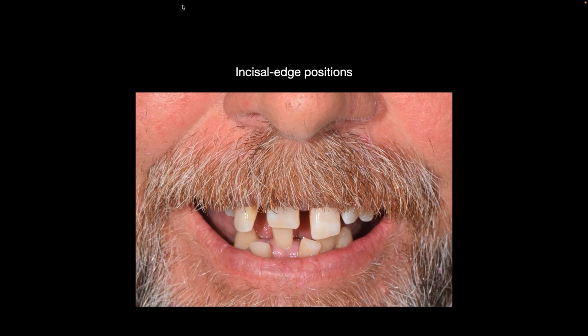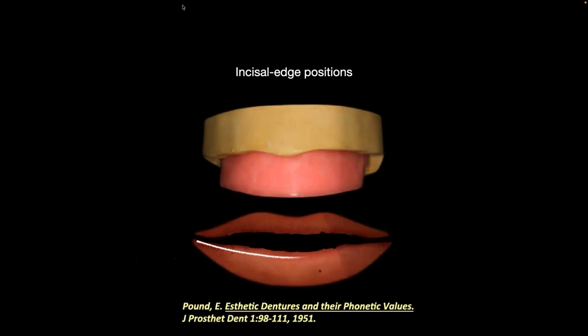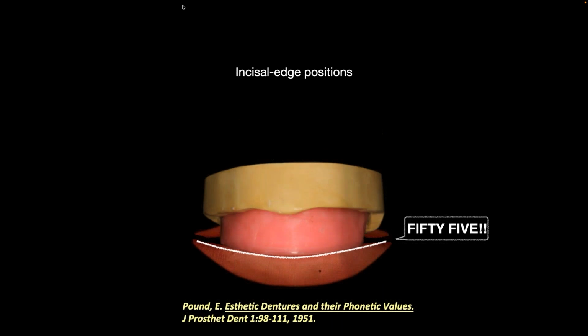So yeah, we need to go to our intermaxillary records and we need to go to our jaw records to determine which tooth is in the proper position, or if any of these are in the proper position. And one of the most important things would be phonetics. We have fricative sounds, we have sibilant sounds. Again, I'm not going to go too much into it because the time would not allow it, but there's a wet-dry line and the patient says 55, which is a fricative, the F is the fricative sound. So when the patient says 55, 8 and 9 should hit at or near the wet-dry line.